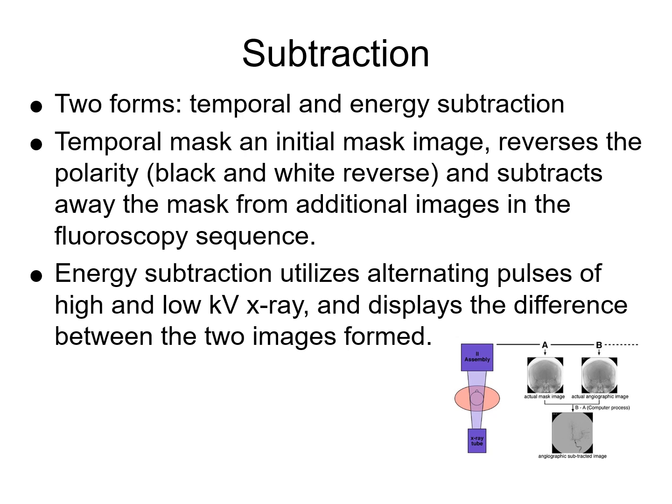Like they're taking a mask, okay? And so the mask, we take the first image, the software does, and it swaps all the black colored pixels for white colored pixels. It completely reverses the grayscale in that image, okay? And then it takes a second image and a third image and a fourth. It takes as many other images as you want, but before it broadcasts an additional image, it subtracts away the negative polarity image. And so what you get is if the pixel is subtracted from its opposite color, it moves it to the middle of the grayscale. It effectively neutralizes the color changes from medium gray, and you just get this slate gray with X-ray with no contrast. Every pixel is colored the same color, the very middle gray shade in the grayscale.